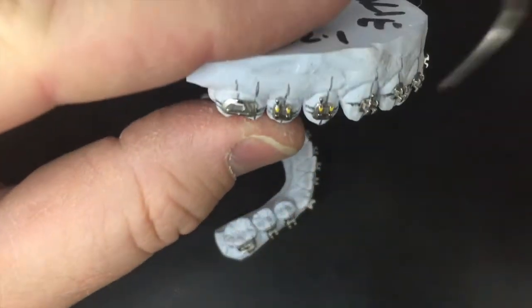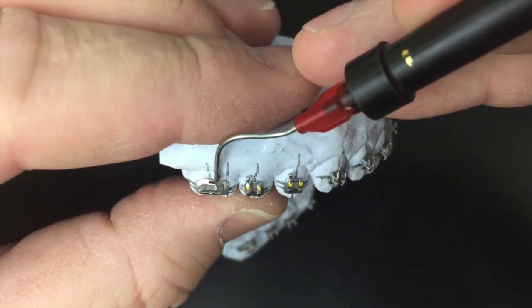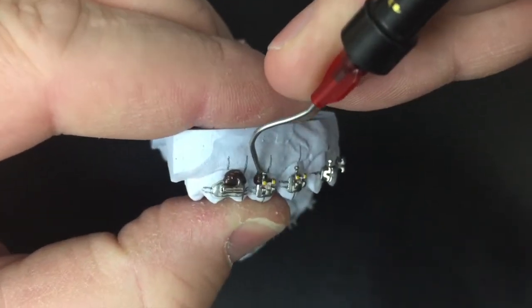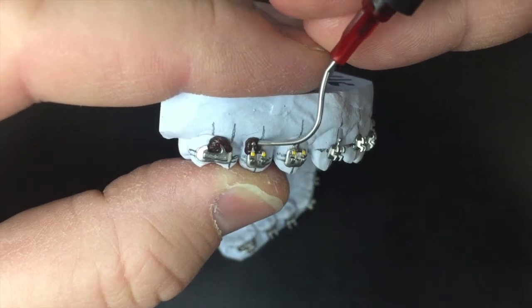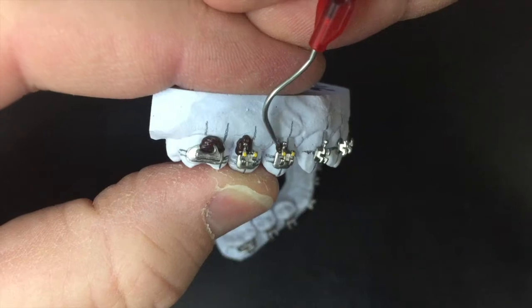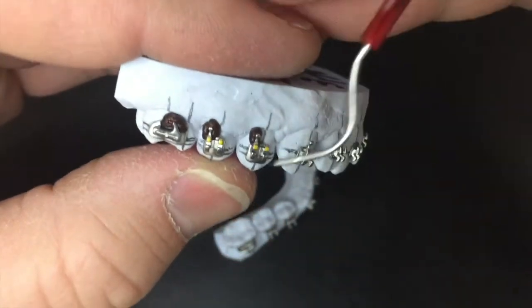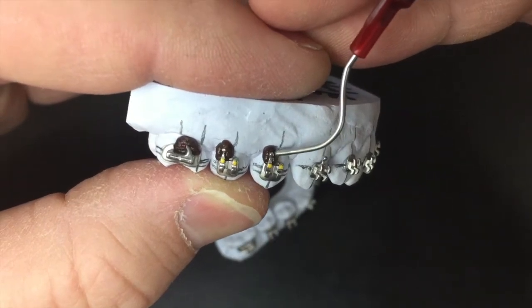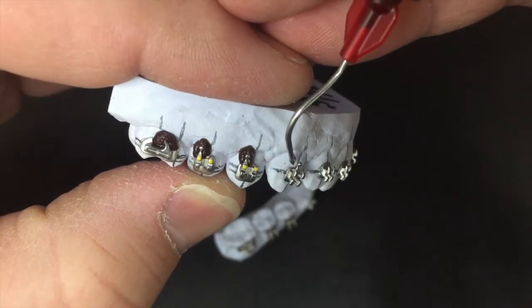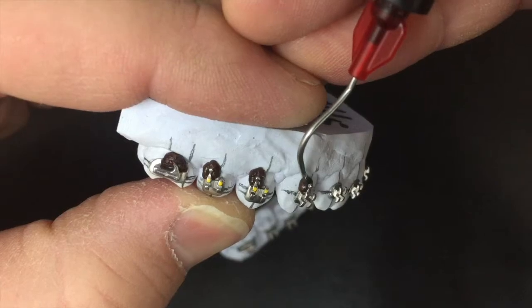Because if you do the tray without that frosting and try to redo it, you'll pull brackets right off the model and cause more pain and heartache. You'd have to have the doctor put the brackets back on, reposition them — it's just not worth the headache, so don't forget to do the frosting. Once I get the frosting on there, I actually have a fan that I put these models in front of to dry them faster than just sitting in normal air.